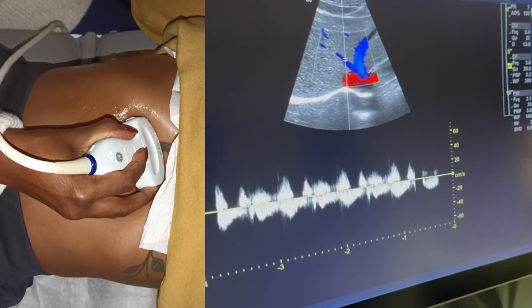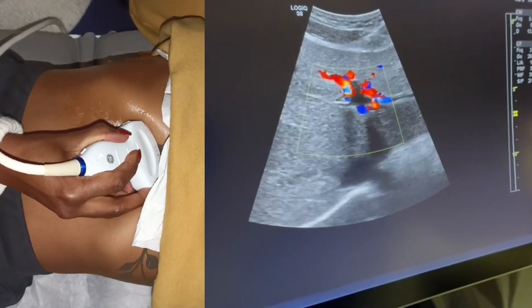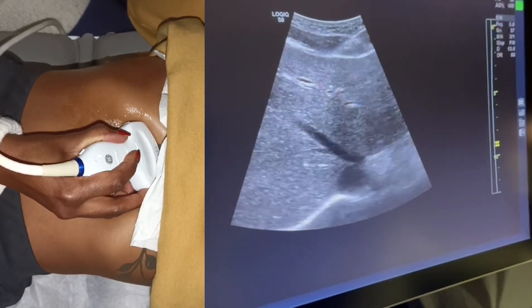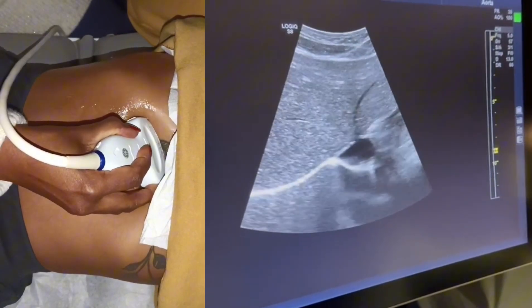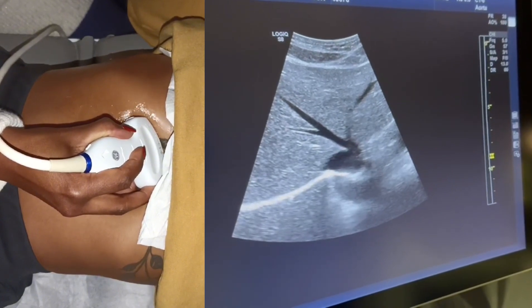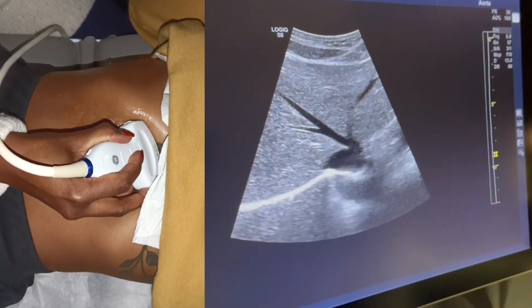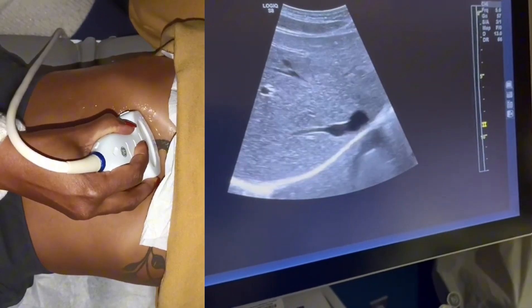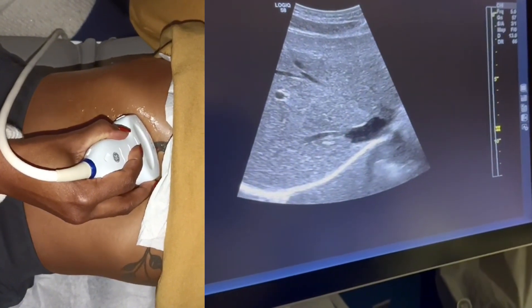You can see the waveforms within the hepatic veins are a little bit pulsatile. Looking at the right, middle, and left hepatic veins: the middle and the left come together and dump right into the IVC, while the right hepatic vein comes on its own and also dumps into the IVC.